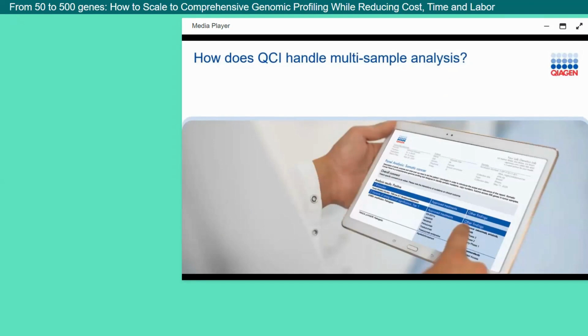The last topic I want to touch upon is rather emerging, as most labs perform tumor-only analysis. However, several academic institutions have implemented a tumor-normal analysis workflow, and liquid biopsies are gaining broader traction, having the advantage of lower procedural risk for patients and the possibility for longitudinal tracking.